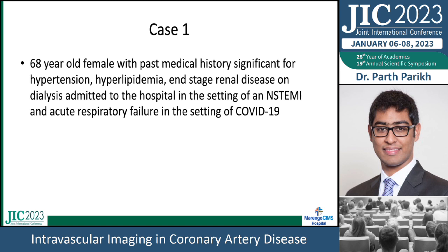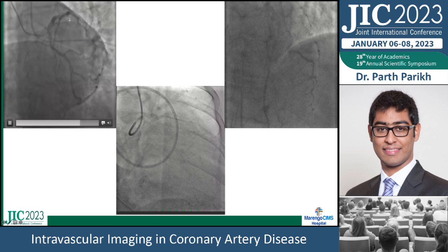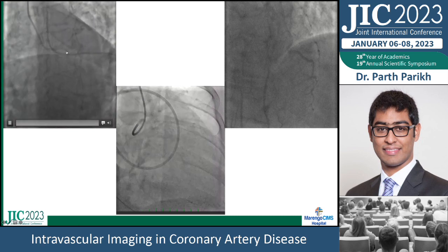So just going over a few cases now. We have a 68-year-old female, past medical history of hypertension, hyperlipidemia, and end-stage renal disease on dialysis. Basically, admitted to the hospital in the setting of an NSTEMI and acute respiratory failure in the setting of COVID-19. Undergoes a diagnostic heart catheterization, which clearly shows calcific disease in the left main, LAD, and circumflex as well.